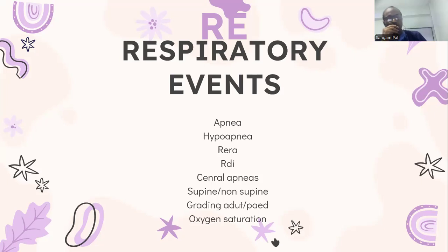So the number of apneas and hypopneas occurring every hour of sleep is called the apnea hypopnea index. If we include RERAs in this, it's called the respiratory disturbance index, that is RDI.